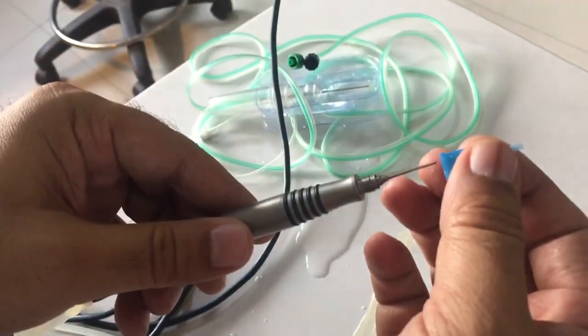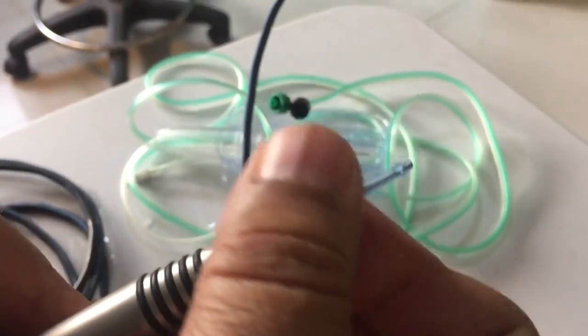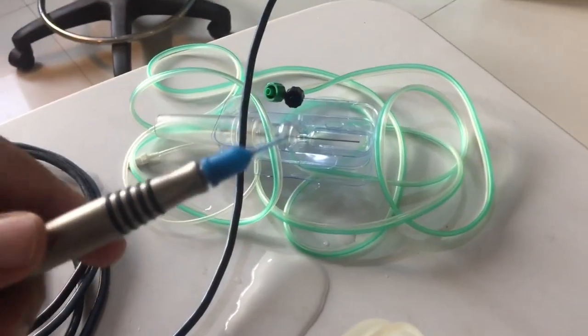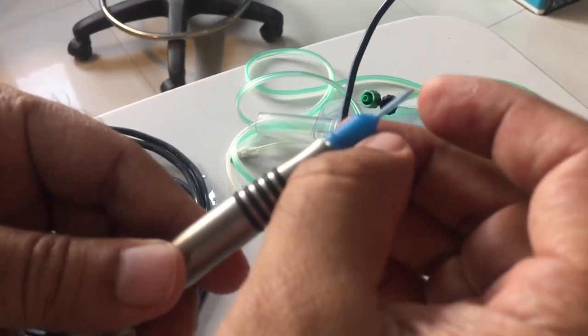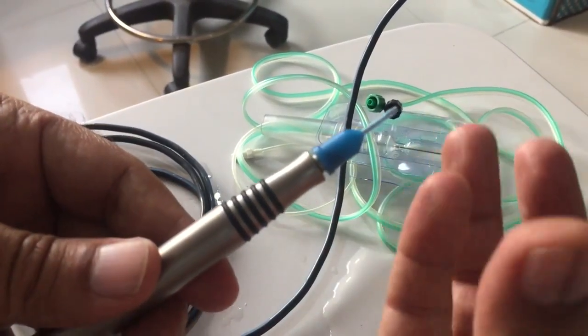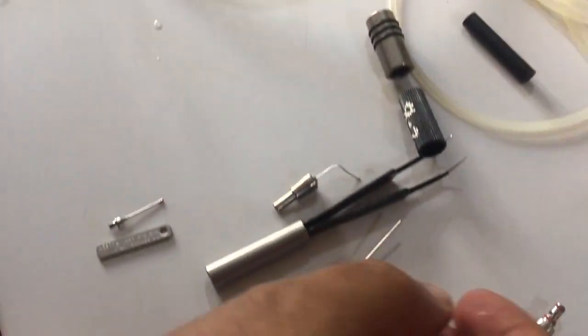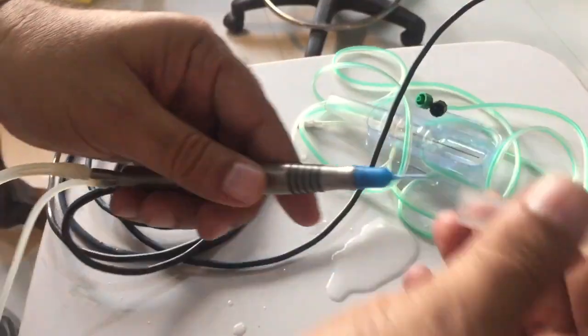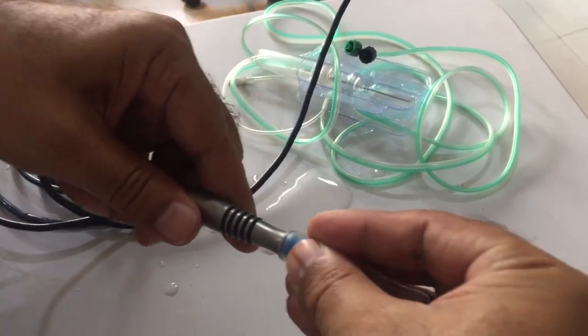After mounting the tip, you can mount the sleeve on the tip, and you should ensure the front 1 mm, the front broad part of the tip, is out from the sleeve. So then you mount the chamber on the tip. Here is the test chamber. You can mount it on the tip. It should not be free.